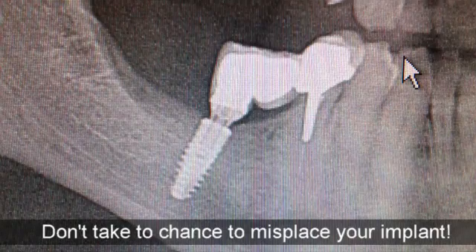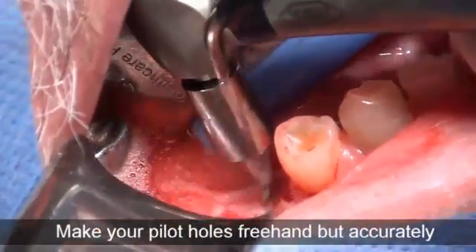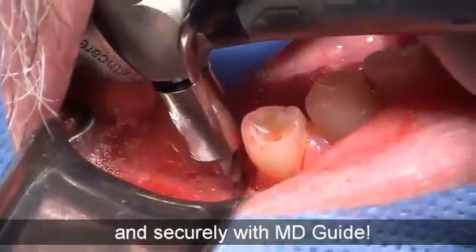Don't take a chance to misplace your implants — it's your job. Make your pilot holes freehand, but accurately and securely with MD Guide.